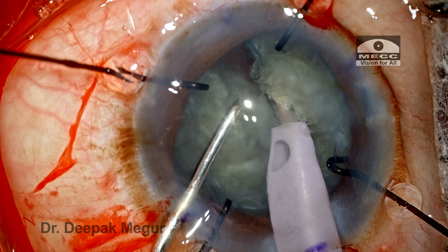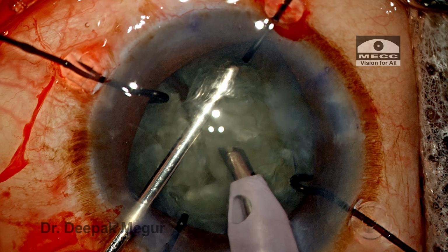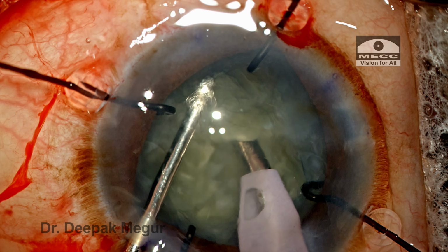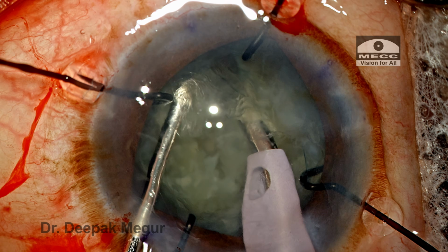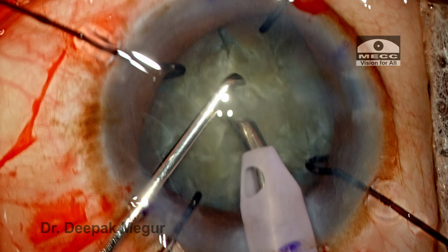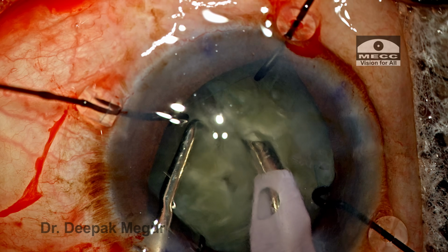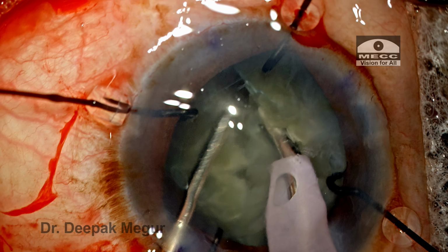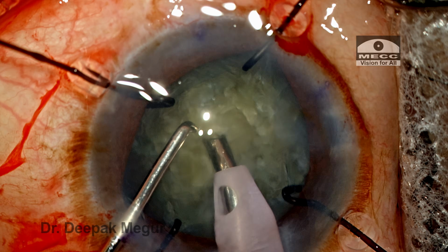The nucleus density is not very high. It's about grade 3 nucleus, so dividing the nucleus is not a problem. The only problem is when you're trying to do the lateral separation, since the zonular health is not so great. The lateral separation maneuver takes a little bit of extra effort. During all these maneuvers, I need to be mindful that caution has to be exercised at every step. I need to be as gentle as possible.